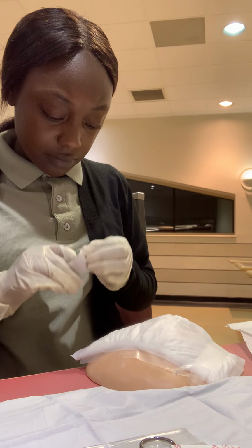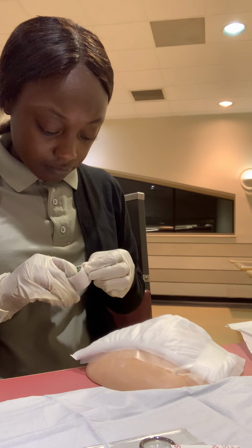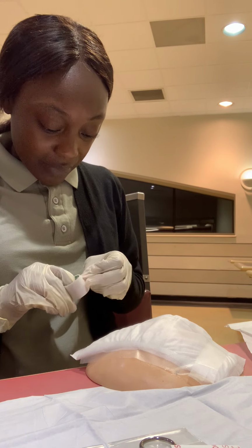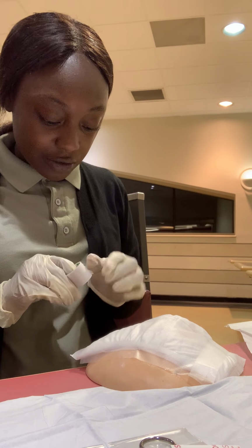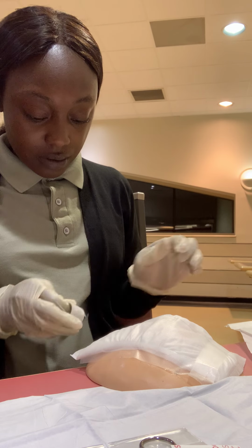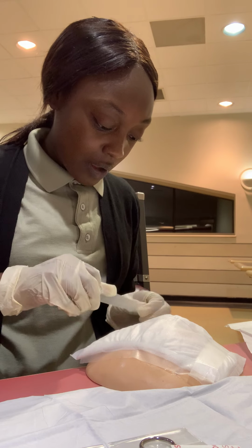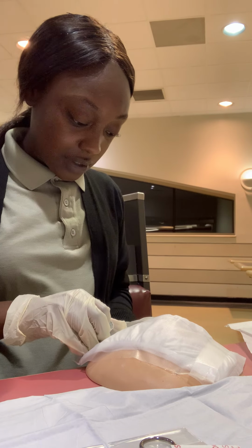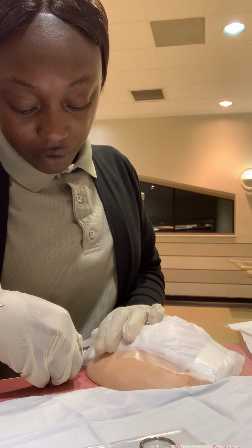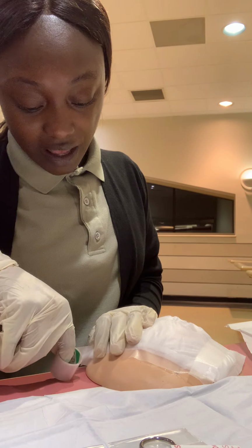The tape. Come on. And I just want to say that the bandage pad is extremely too big for this wound type. So when doing wound dressing, I would want to ensure that whatever bandage I am using to go on top of the dressing is the appropriate size and fit.